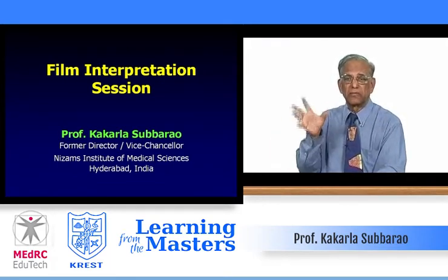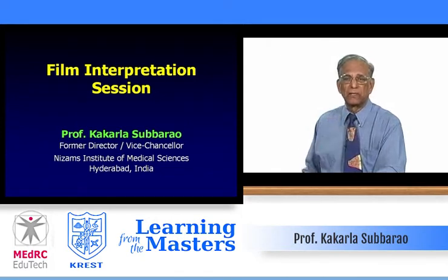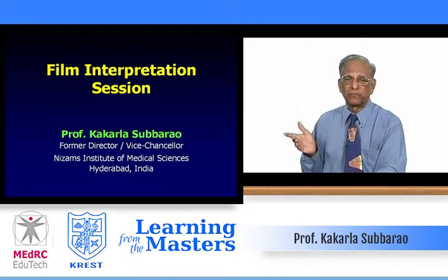Say, plain film of the chest, there is a shadow in the right upper lobe. And then can he give a final diagnosis? No. Then he may ask for a lateral or an oblique or a CT or an ultrasound to know whether it is cystic or solid, or MRI, depending upon the appropriateness of the situation. Let's proceed.